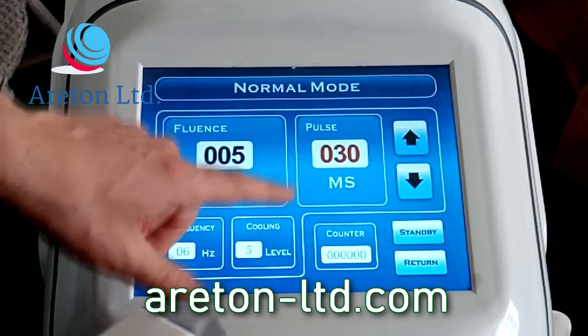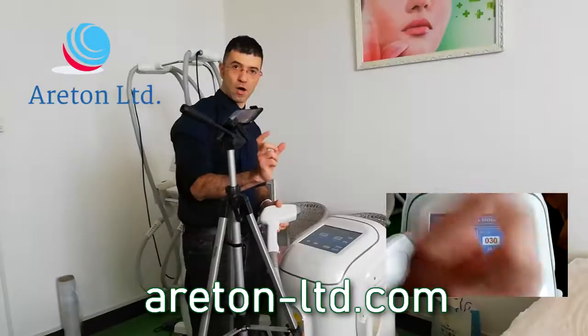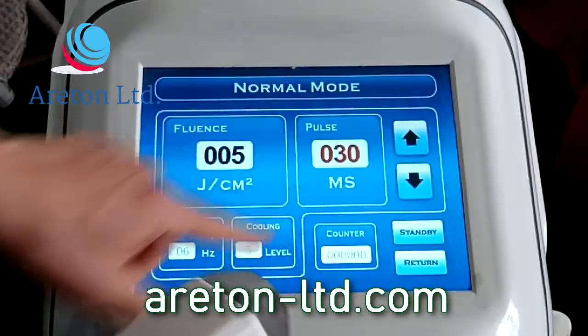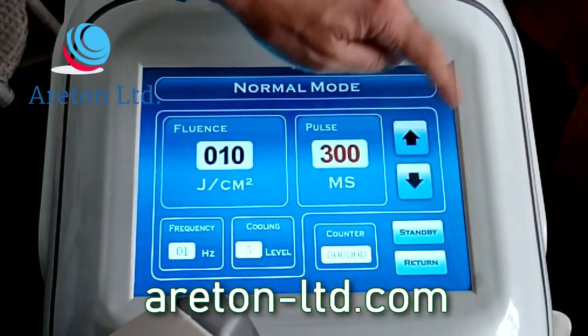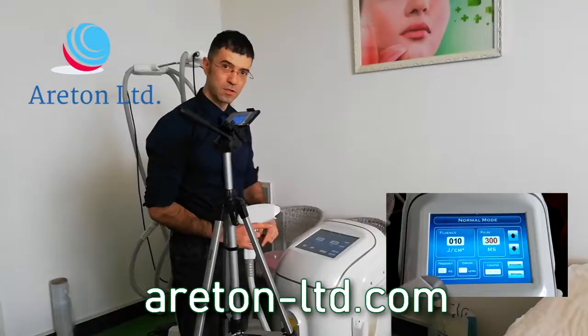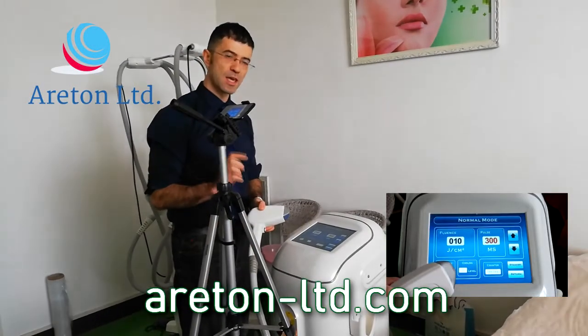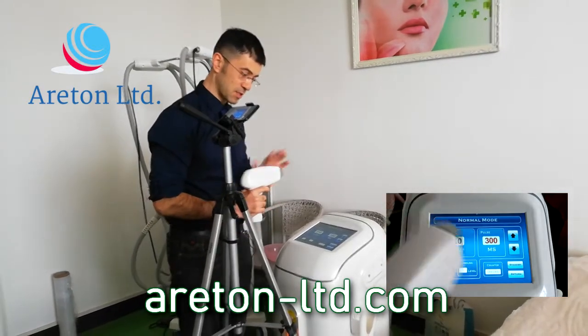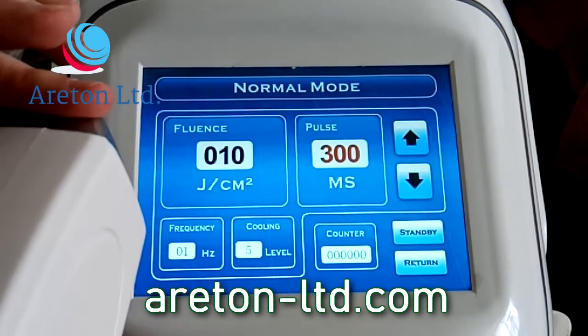The pulse is the length of the duration of that pulse. In this case, it is 30 milliseconds, and I'm going to go higher just for the sake of it. I'm going to go to the maximum that it allows, which is 300 milliseconds. So it's 0.3 seconds that we're keeping this light on for.